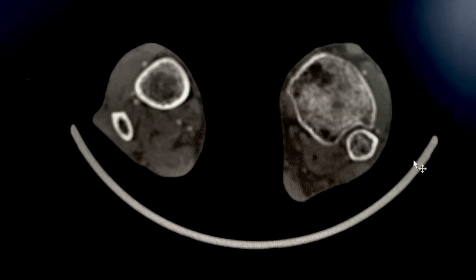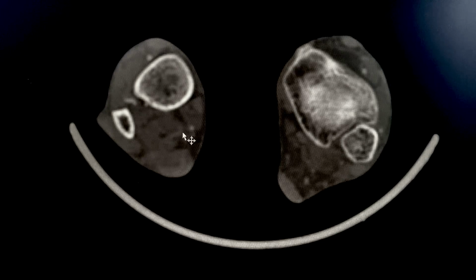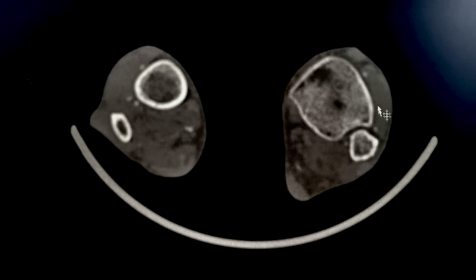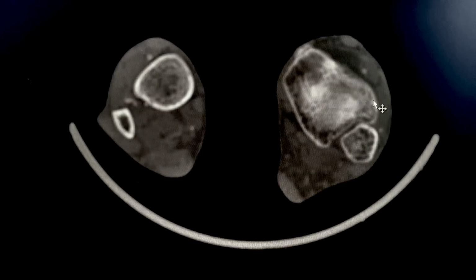And we are now going all the way to the ankle. We have now reached the level of the ankle, where you have all the three arteries here intact, and on the left, you are only left with the peroneal. The peroneal goes on, and the anterior also goes on intact.